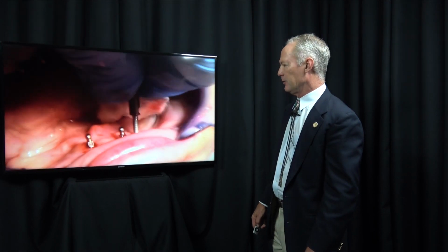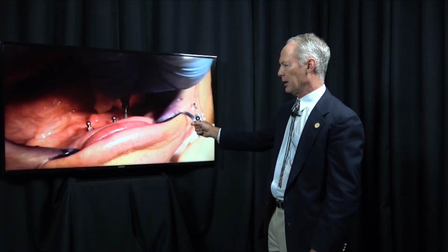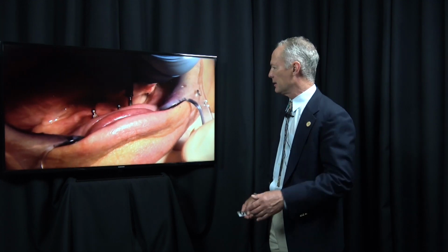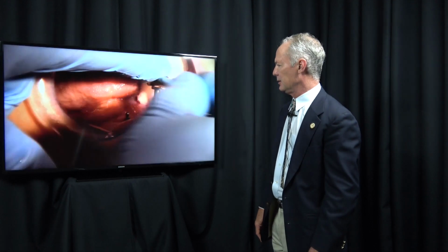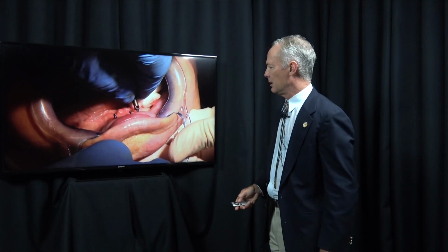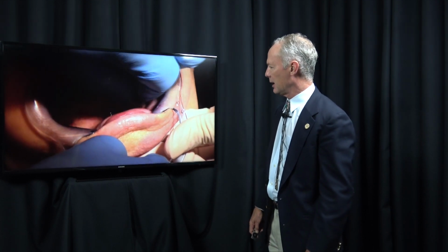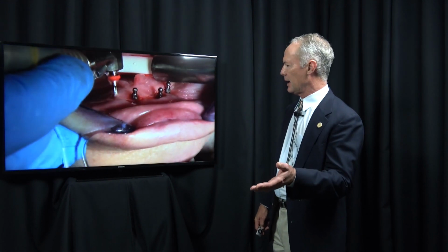Something else to think about, we've got to be conscious of attached gingiva around implants, just like we are conscious of attached gingiva or keratinized gingiva around natural teeth. So if there's not enough attached gingiva, you should do either a free gingival periodontal graft from the roof of the mouth, or now we use perioderm. And I have a video on perioderm placement in relation to small diameter implants and minimum attached gingiva.